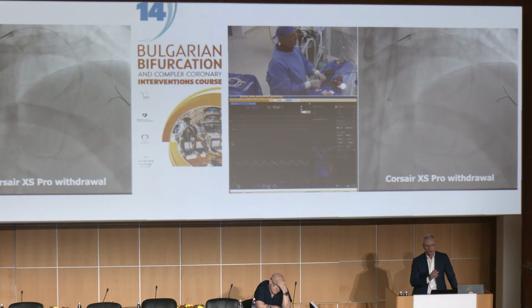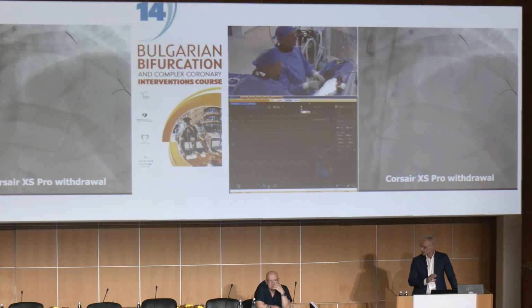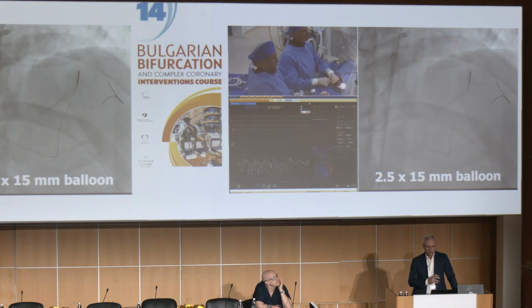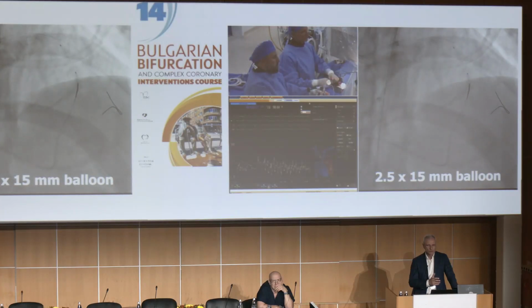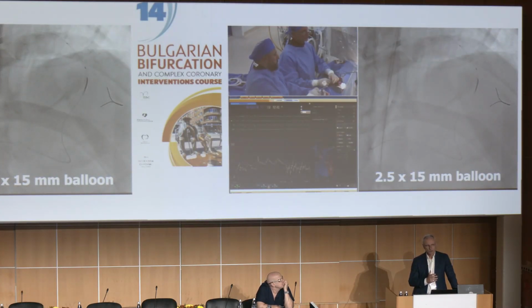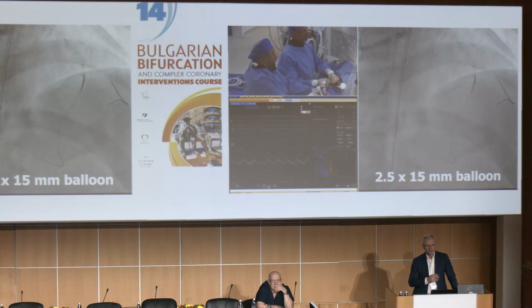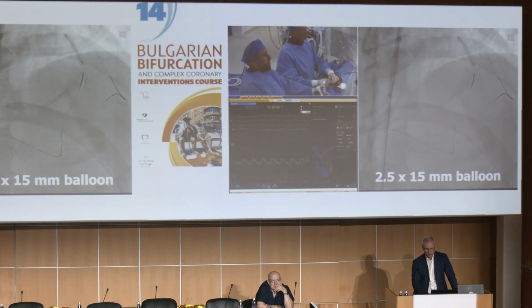So you see some more details, because the topic that was given by Dr. Gelef is to address what is contemporary, what is breakthrough. CTO has reached a maturity, and there are no major breakthroughs on that. But what you have to do is improve the small things that are really improving the effectiveness of these devices: less contrast, less radiation.